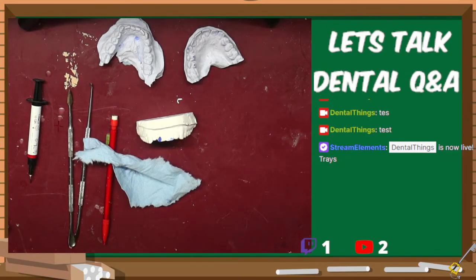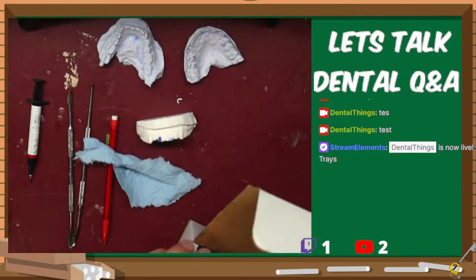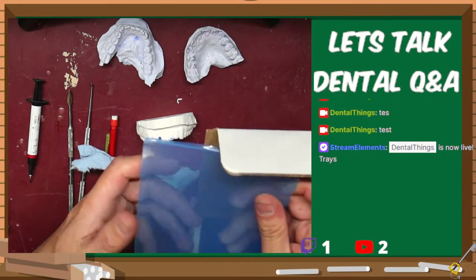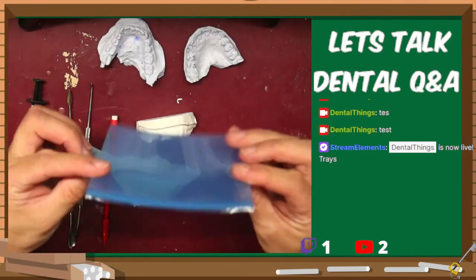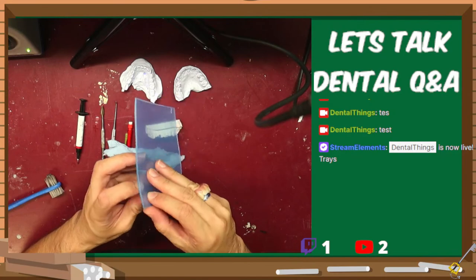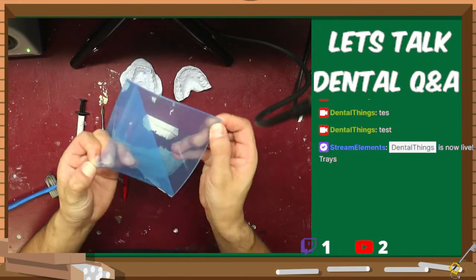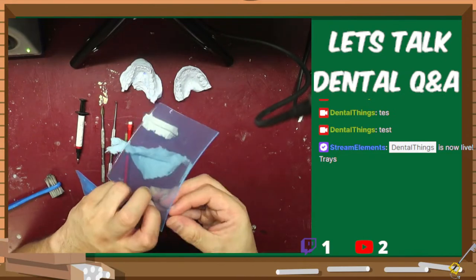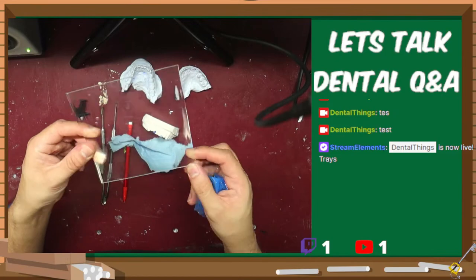And what I want to use is a 080 material here. And this is decent size for a mouth guard. Now with this material, even though it seems like it is blue naturally, it actually has a film over it that we can go and remove. If I can find the seam. Come on, seam, where are you at? And we got our nice, clear mouth guard. Pretty neat.